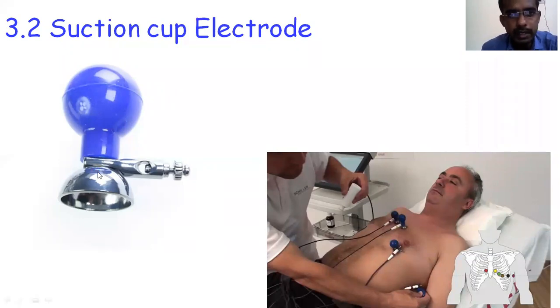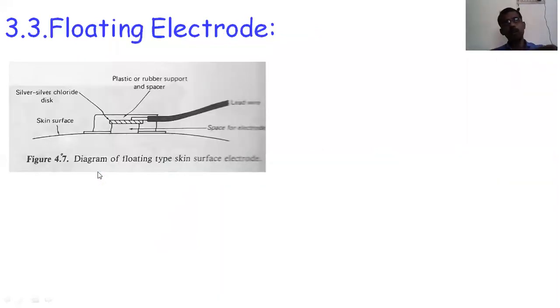The third one is floating. Floating means, medically, that you paste it on the surface. Float means it is not attached, right? Floating, that's what float means. Also, when we say floating, water comes into the picture or something like that. Similarly, in suction or in needle or in micropipette, the metal was trying to attach to the body. Even in the previous one, the metal was trying to get locked to the body, either in suction or on the metal surface.